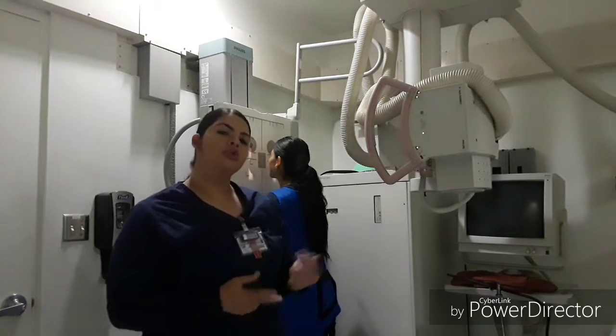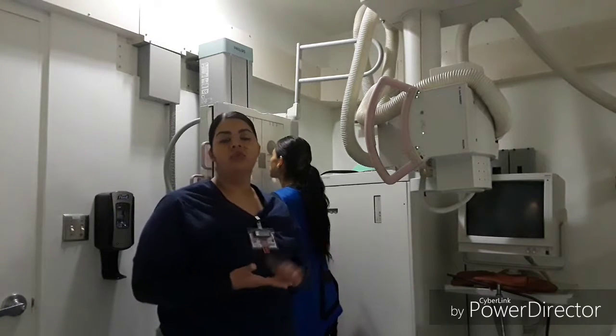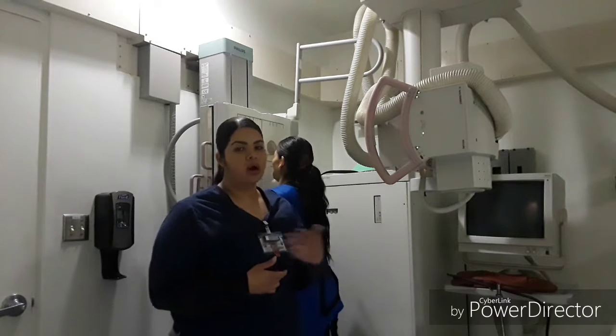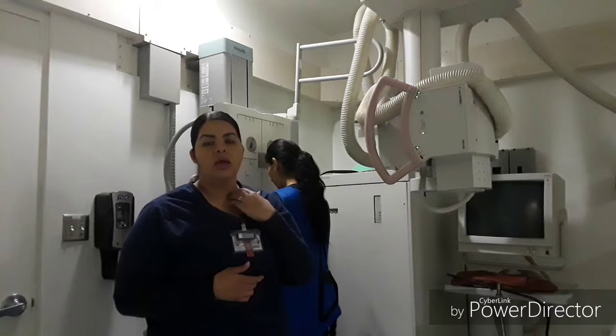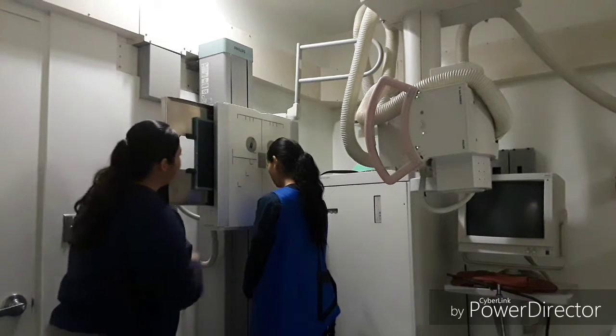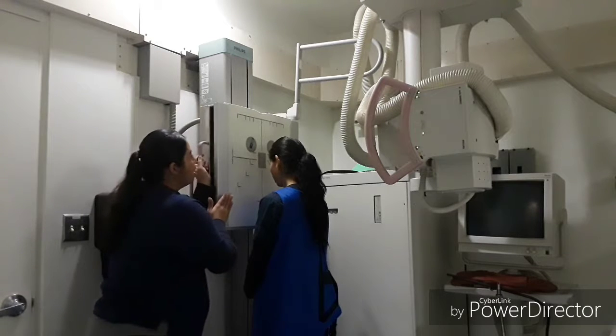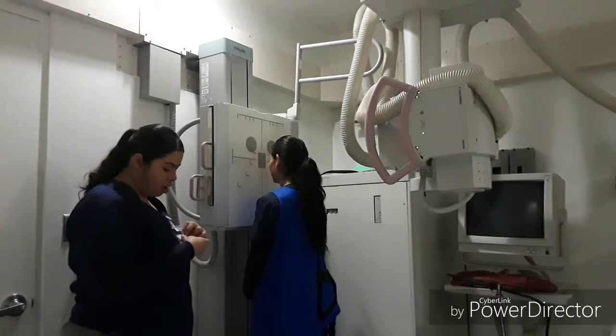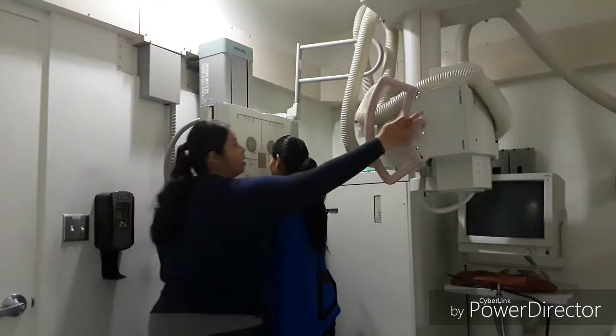For this projection, I would do approximately 85 at 20, and then I would move on to my SMV projection for our ethmoid and sphenoid sinuses. I would change my IR, put in a new one, portrait again. I will be changing my marker to the right marker, since it's going to be the patient's right side.